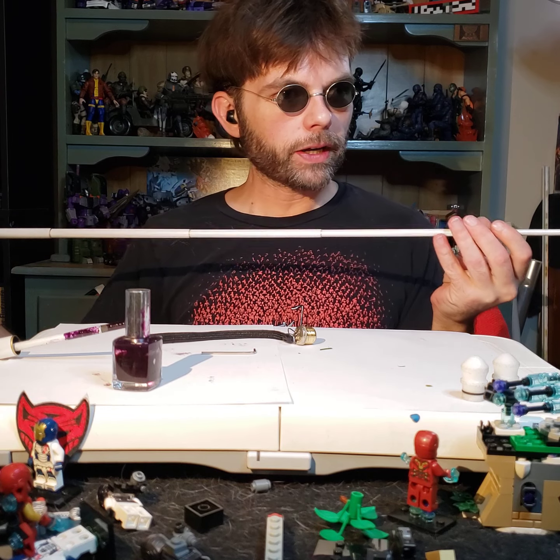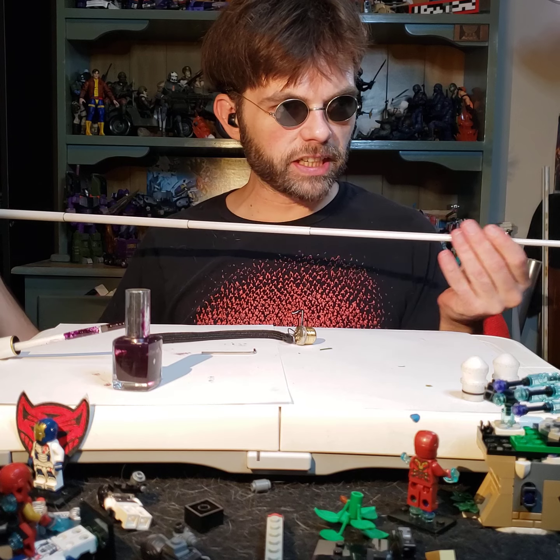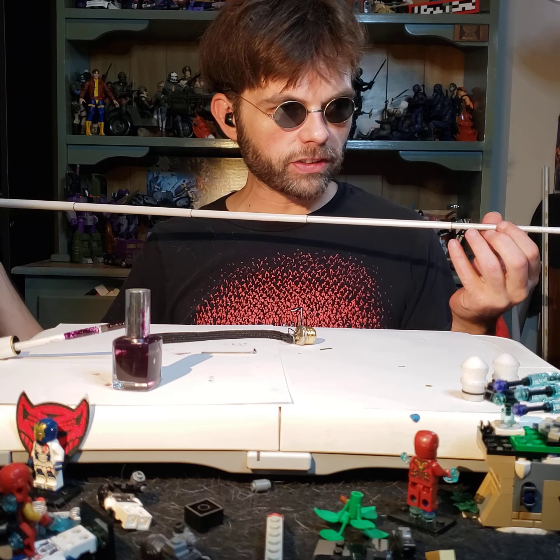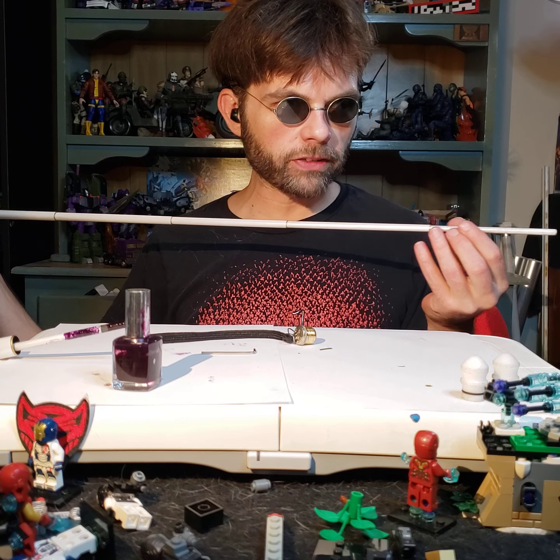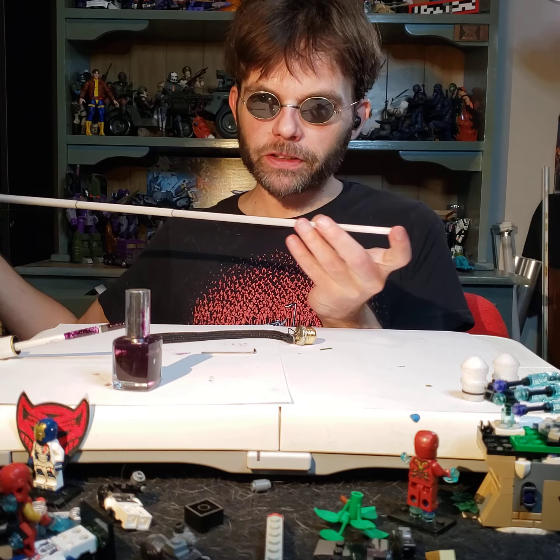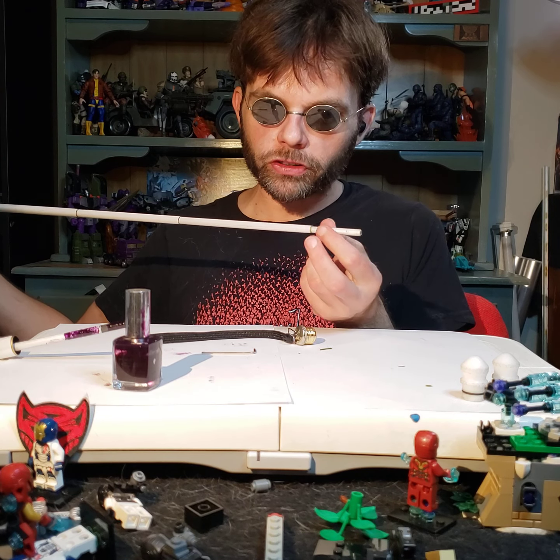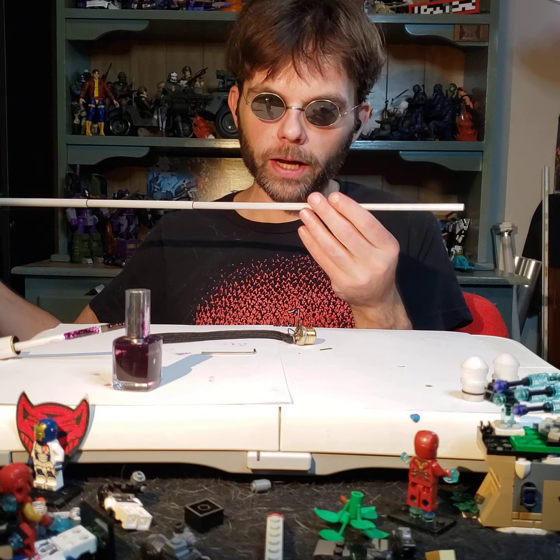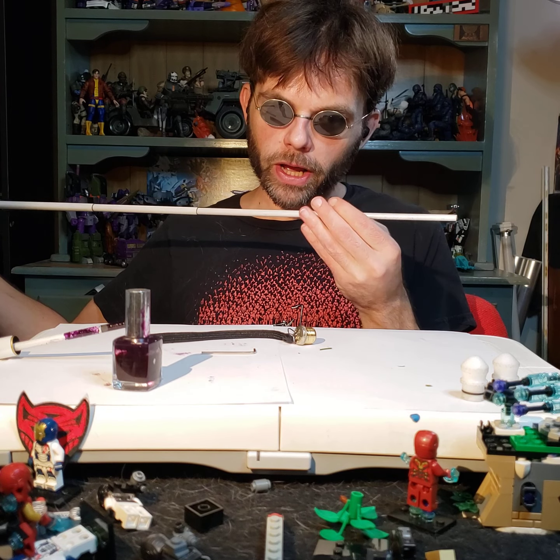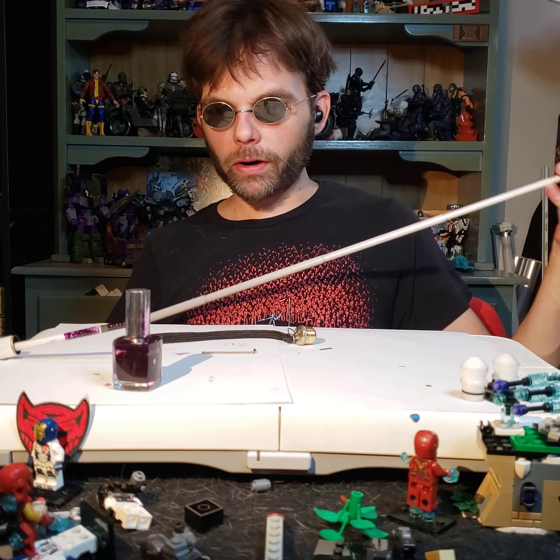You want your shaft to be stiff and rigid, except the tip. Just the tip needs to be loose, because you can either use this as a tapping cane or as a spinning cane, and I like using it as a spinning cane. If I pop this tip down and make it loose, it spins freely and moves back and forth, which acts as a shock absorber for those rocks and corners. And with that extra bit in there, oh yeah, that grips well. That is going to ensure that my cane doesn't fall apart anytime soon.